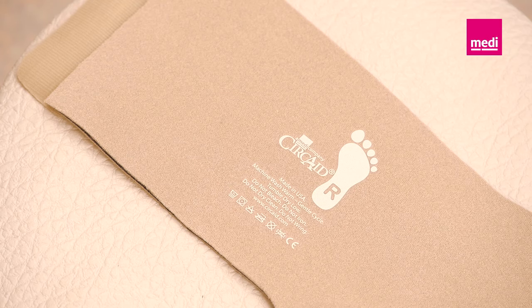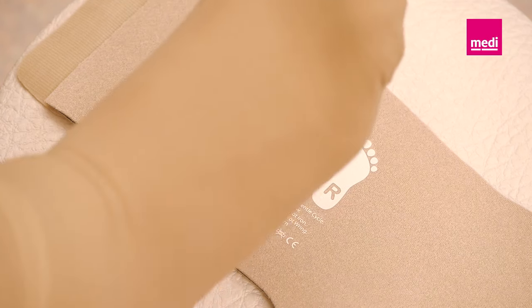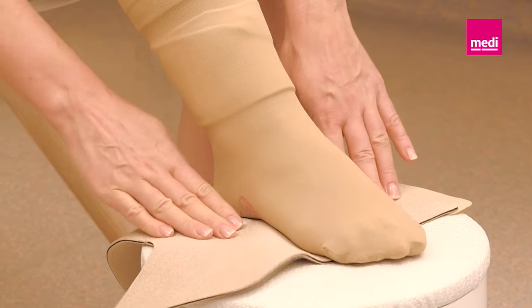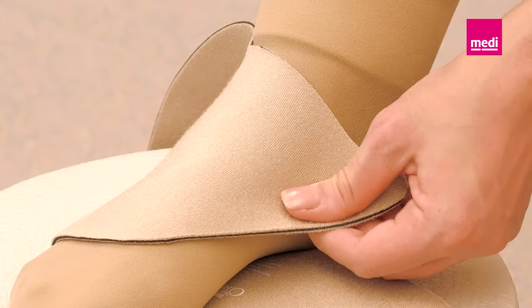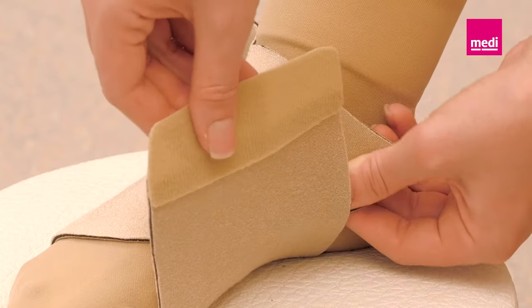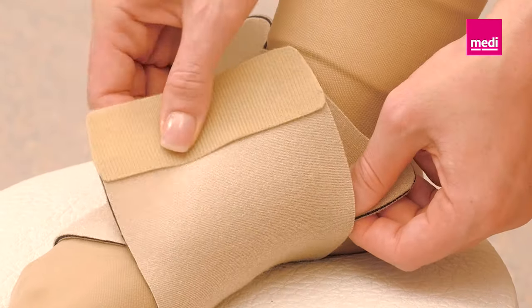For the right foot, the right foot symbol should be visible. Center the arch of the foot with the footprint symbol. Pull the outer strap with firm tension to the inner ankle and hold the strap in place.